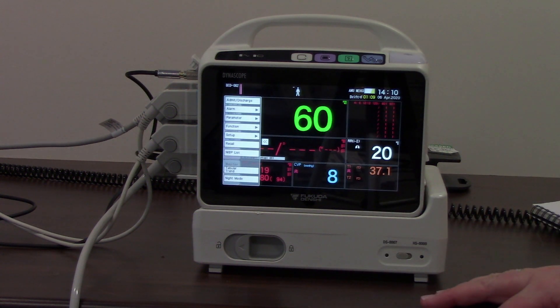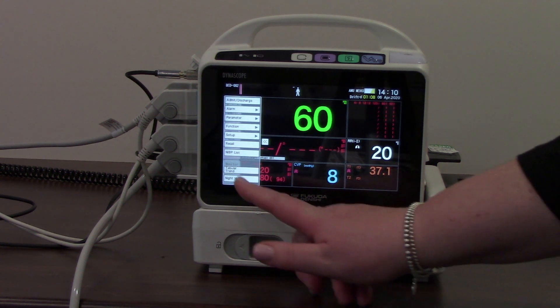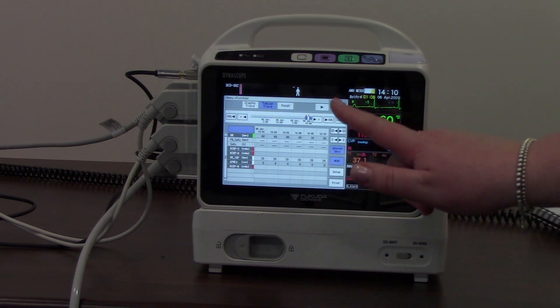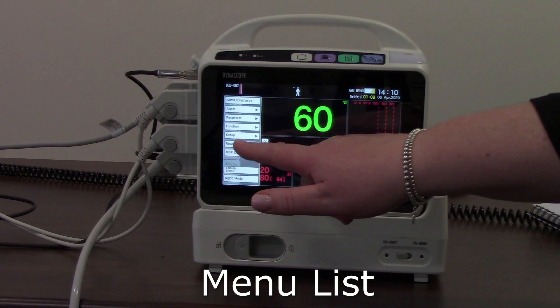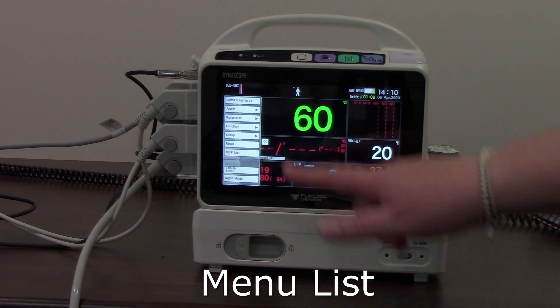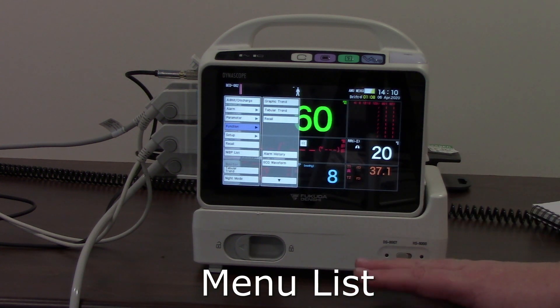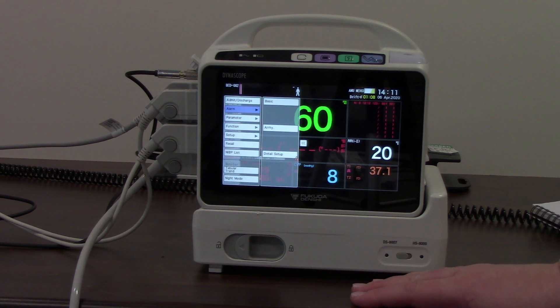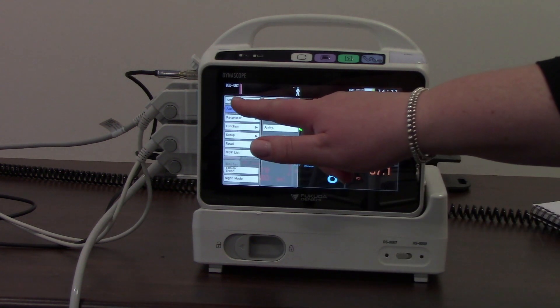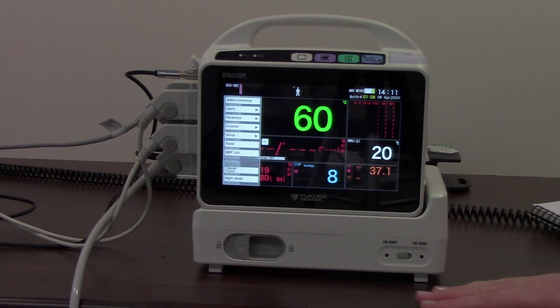Back in the menu list there are a lot more functions, though some are repeated. For example, I can go back into table trend, look at my recall, or go into function to bring up all the different trend options. If I go into alarms, that brings up everything to do with alarm settings. Or going into admit and discharge brings up that admit/discharge menu again. There are lots of ways to access the different windows and menu options available.